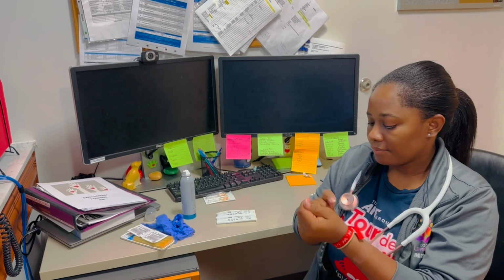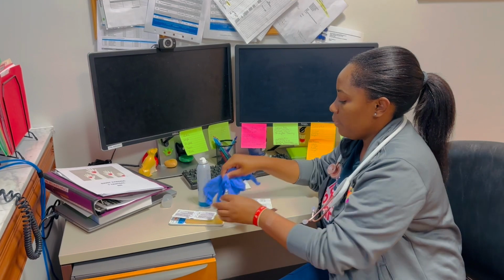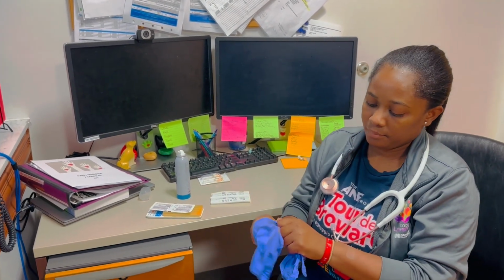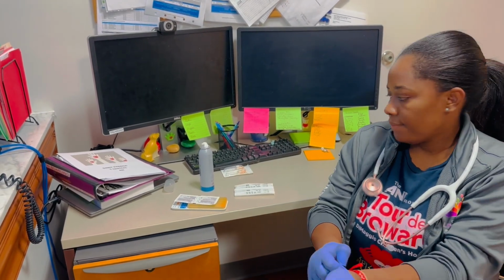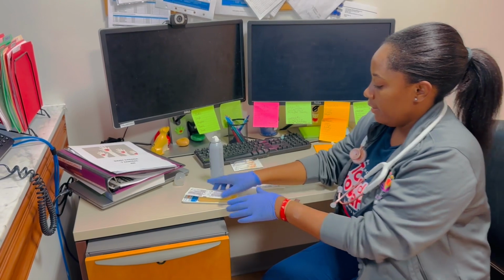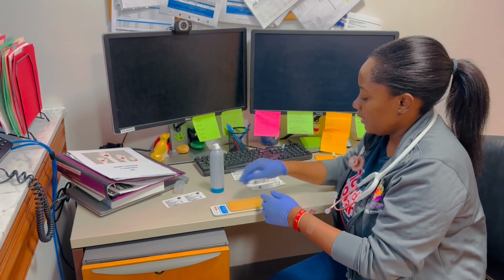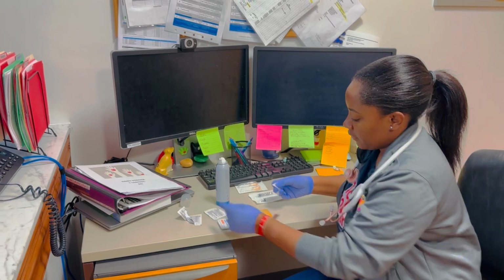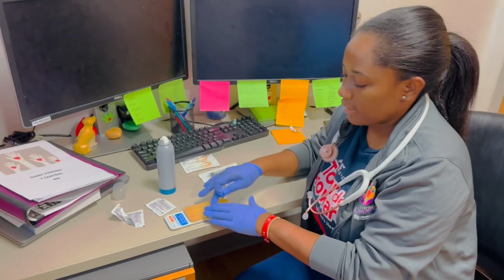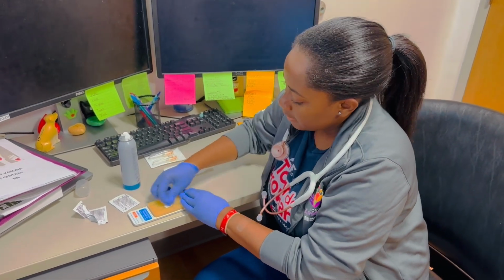I'm going to go ahead and do some hand hygiene, right? Perfect. So I'm going to go ahead and just apply my gloves. All right. So this is my patient. What I'm going to do is clean the site. I already have the site that I want to use. Like I said, you can use the back of the arm or you can use a fatty area in the abdomen. So you're going to go ahead and clean.